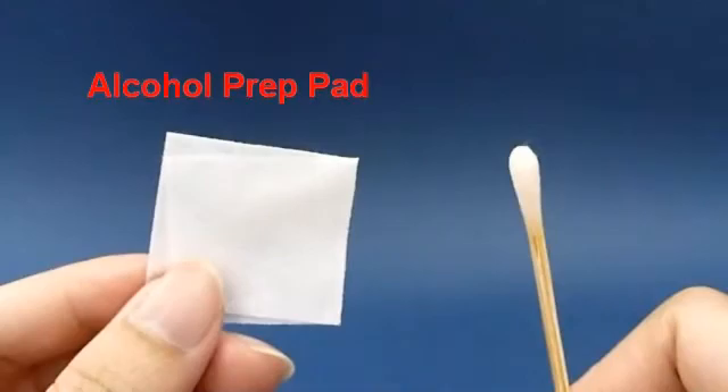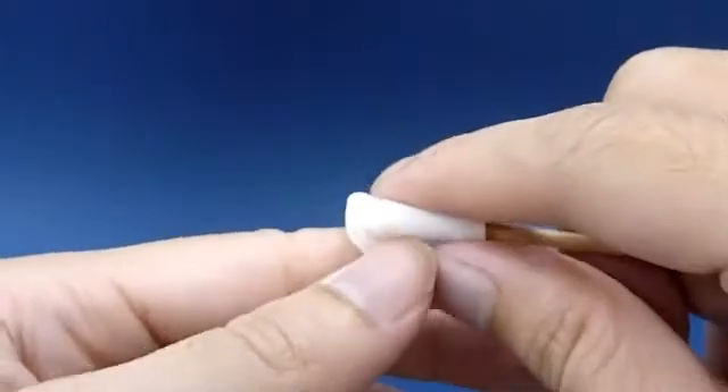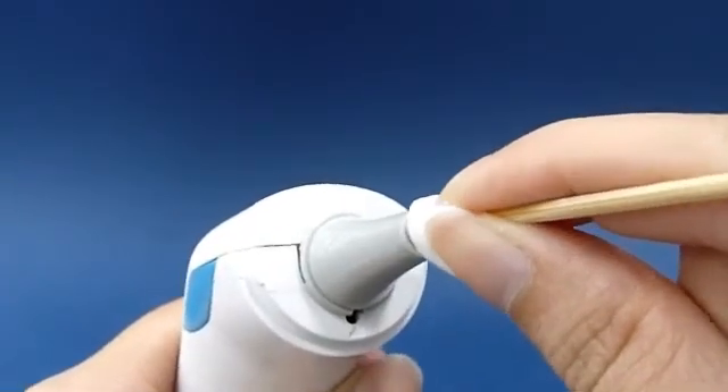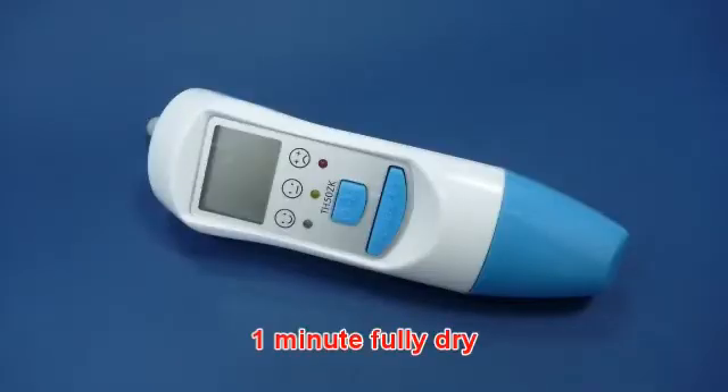If there is no 70% alcohol, use an alcohol prep pad to soak the cotton swab. Allow the probe to fully dry for at least one minute.